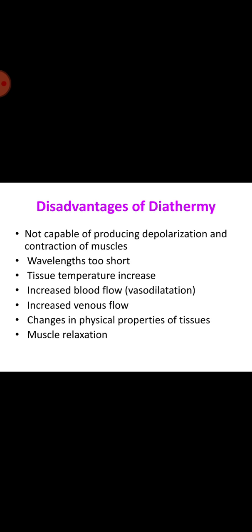A visible arc forms when the electric field strength exceeds 1 kilovolt per millimeter in the gap and disappears when the field strength drops below a certain threshold level. Biological tissues are coagulated by thermal means, with the required temperature maintained at around 70 degrees Celsius. In this coagulation method, that is desiccation, needle point electrodes are stuck into the tissue and kept there, and depending upon the intensity and duration of the current, a high local increase in heat is obtained and the tissue changes due to drying and limited coagulation.